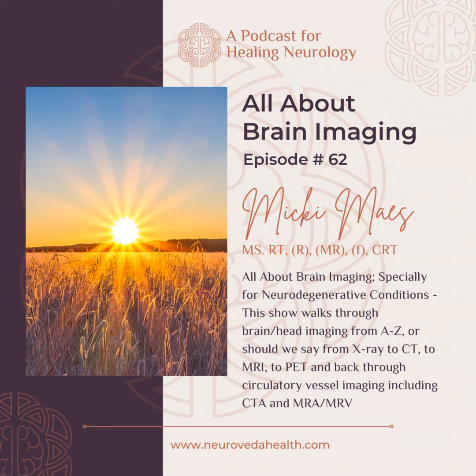So our most basic option would be just plain X-ray, and that uses electromagnetic energy beams to penetrate the skull. And so for the most part, X-ray shows bony trabecula and bony detail really nicely. It doesn't show a lot of soft tissue really exquisitely.